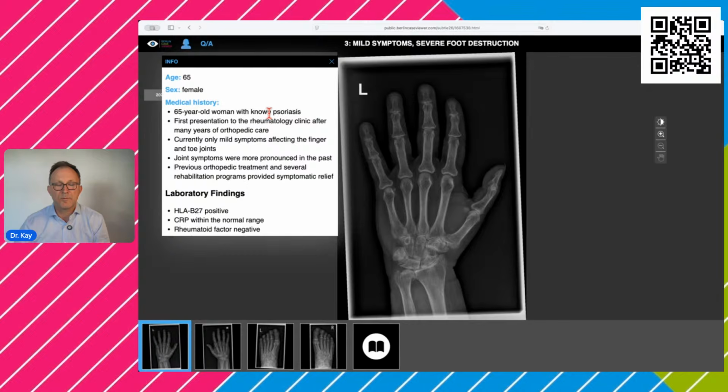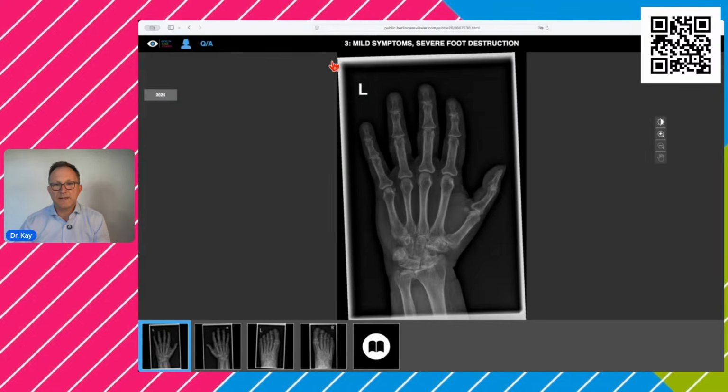So my advice is, if you have a medical history of psoriatic skin manifestation, you should take at least one more closer look compared to a patient who just has joint pain, to search for erosions and periosteal reactions. I didn't have time to prepare the MCQ, but let's go to this. Actually, I prepared it. Somehow it's not visible. Let's see if I can make it visible for you. No, I forgot. Okay, so let's do the same.